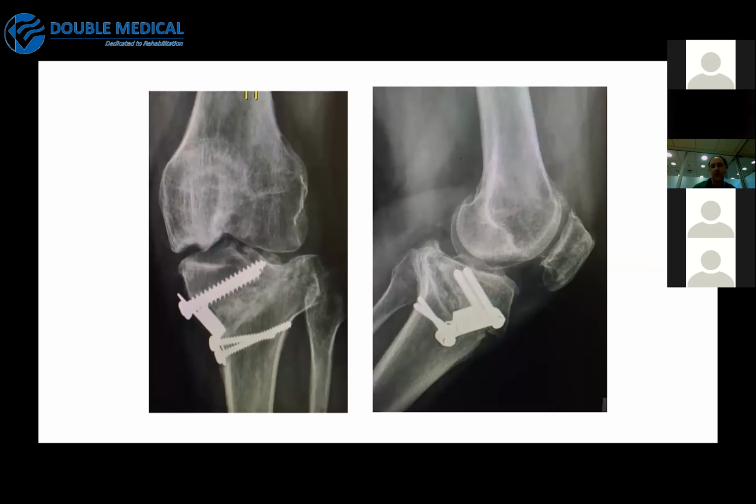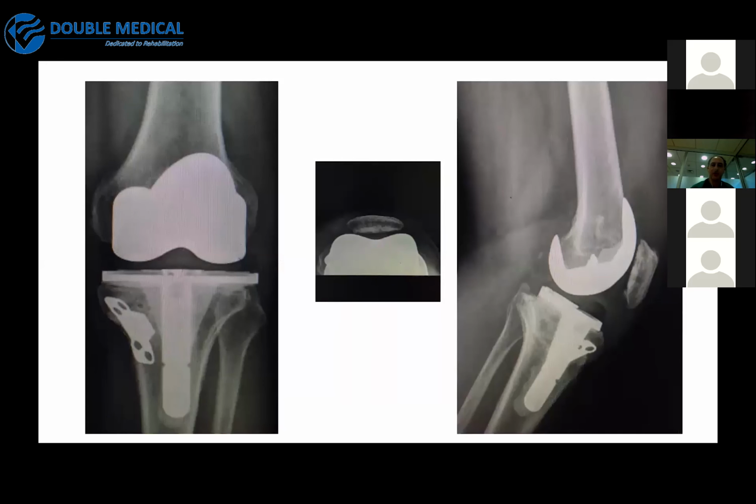So here we see an obese patient with a small implant, with a wrong technique, and that's how the story ended. With a total knee replacement, the osteotomy was almost healed, but we needed to use a knee replacement with a short cemented stem. The patient is out of pain. It's been 6 years and he is still working in the mining industry.